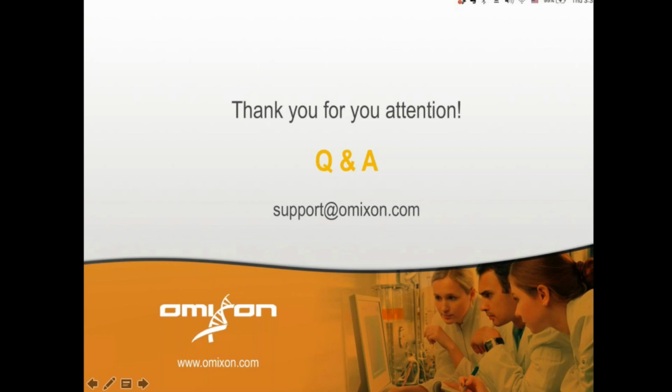Once the IMGT database is officially released, our users will receive the updated HLA database within 6 months, and they will be automatically informed by the software with a message saying there is a new IMGT database available. Would you like to download it?